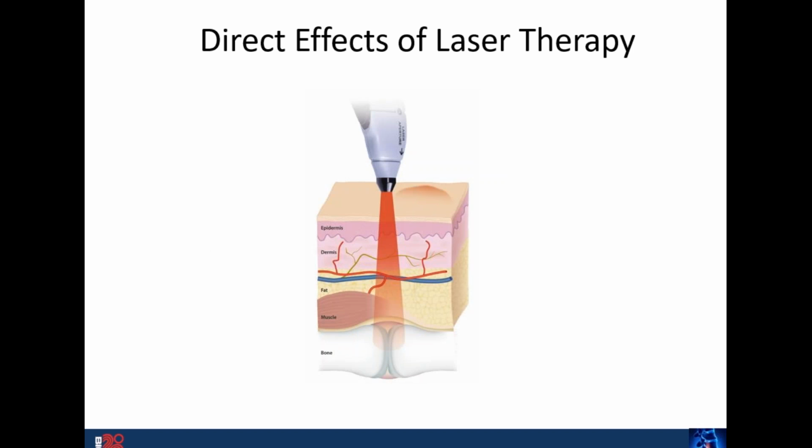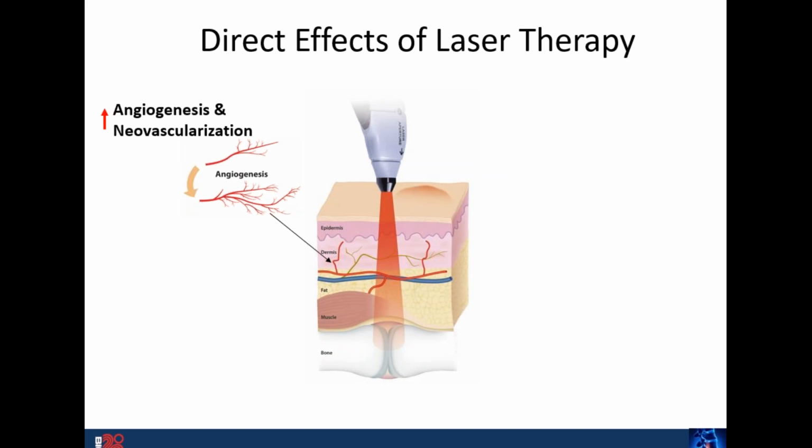So that brings us to what can laser therapy or photobiomodulation do for disc herniations? Well, one thing it can do is help improve blood supply. Now remember that we can't directly improve blood supply to a disc. However, we can improve it to the damaged tissues and structures around the disc herniation, so that's very important.